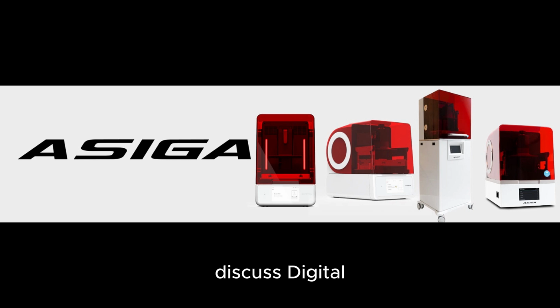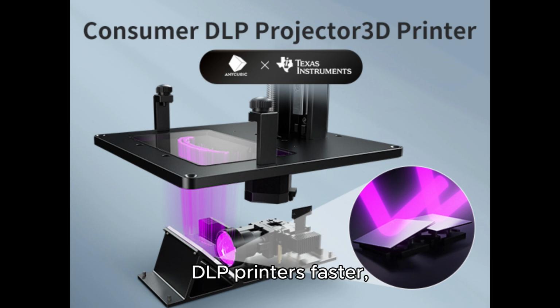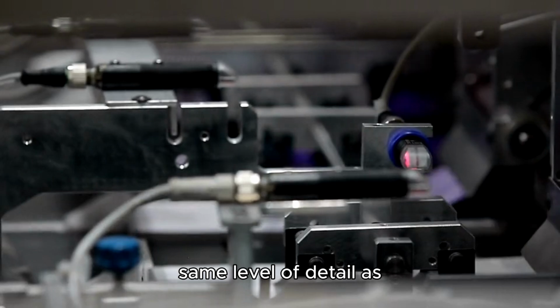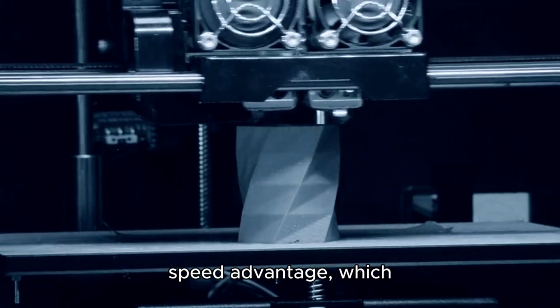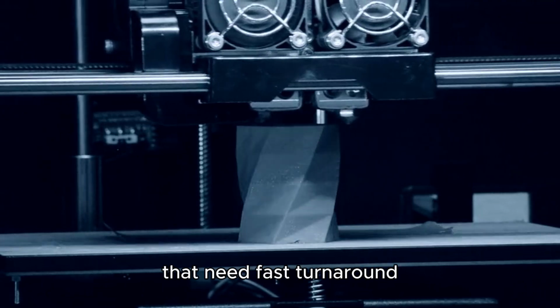Next, let's discuss digital light processing, or DLP printers. DLP uses a digital light projector to cure resin layers all at once, rather than curing each layer one line at a time, like SLA. This approach makes DLP printers faster, often completing prints in less time than an SLA printer of similar quality. DLP printers offer the same level of detail as SLA, but with a significant speed advantage, which makes them an excellent choice for busy practices that need fast turnaround times without sacrificing quality.